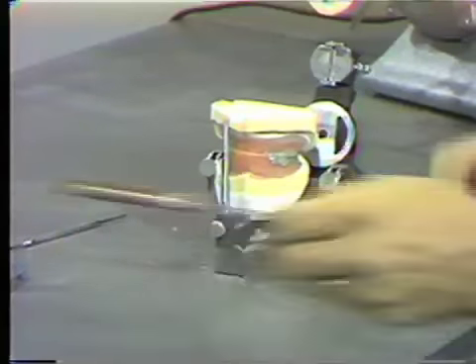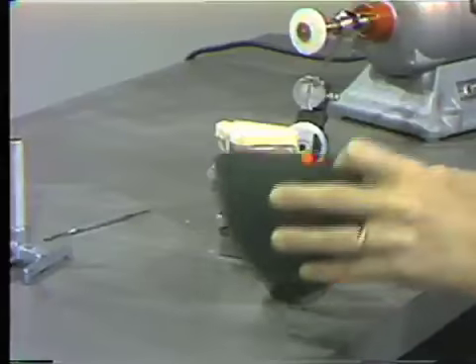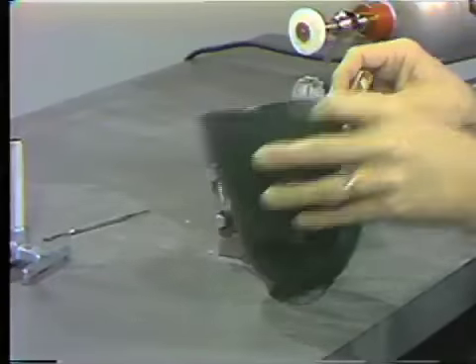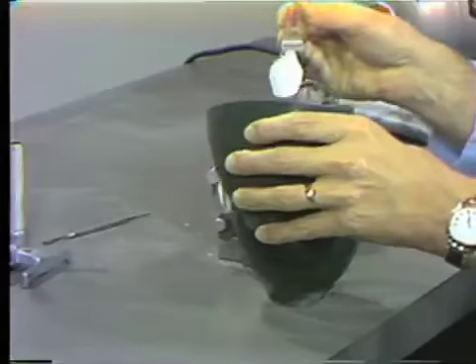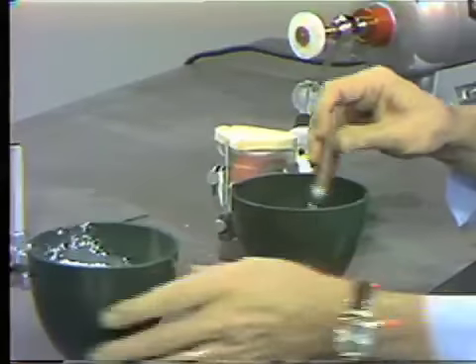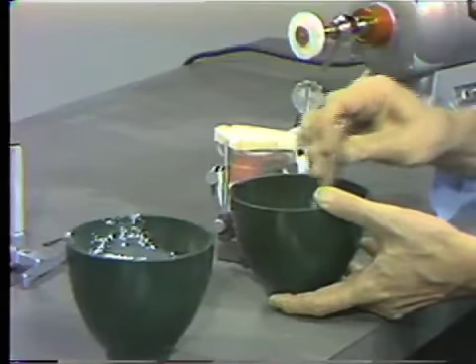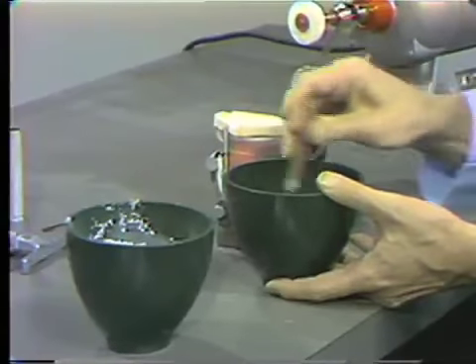We will now mix some plaster. I have some water in the bowl, and we'll add some plaster to it. Not a great deal of plaster is necessary for this procedure at this time. We're only going to mount it preparatory to checking to make sure our relationship is correct. We'll use a rather soft mix of plaster, and we'll place some plaster on the mounting ring and some plaster on the base of the cast.